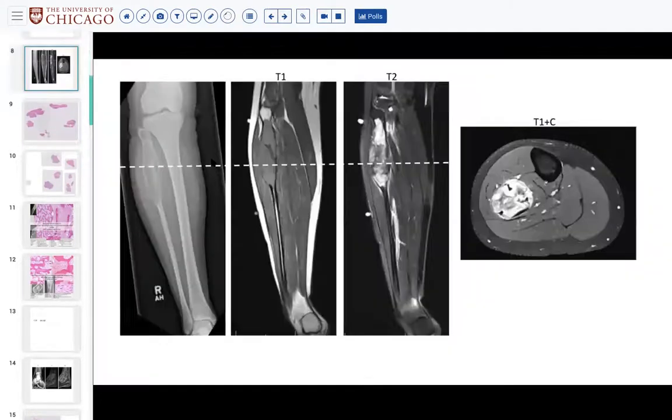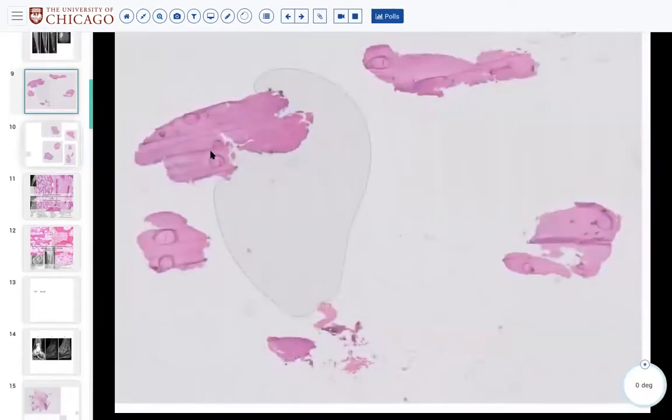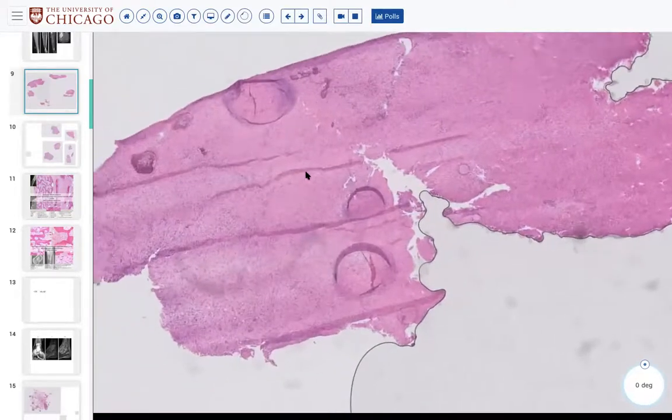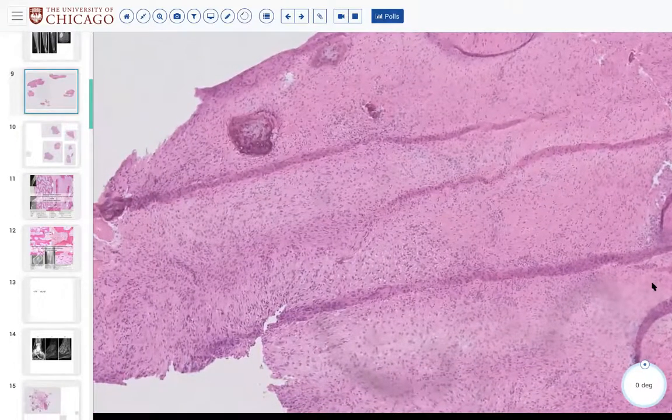So we have basically a lesion that's bowing out the bone, but perhaps not overtly destroying it. You can still see that there's probably some thin rim of cortex on the outside. So it's not overtly invading soft tissue, but it is bowing out the bone. Does anybody want to describe what they see or suggest differentials? Faiza says bland spindle cell lacking atypia.